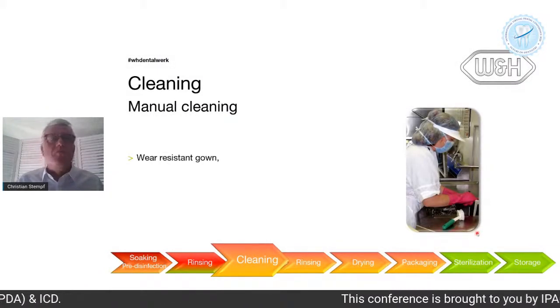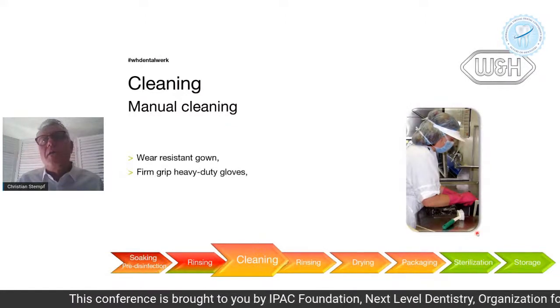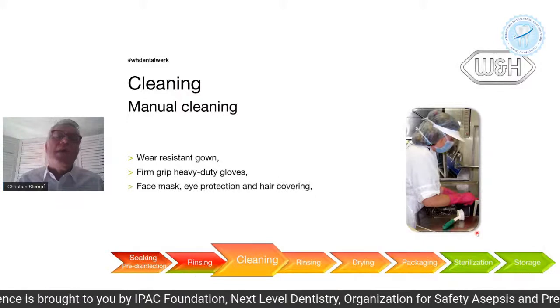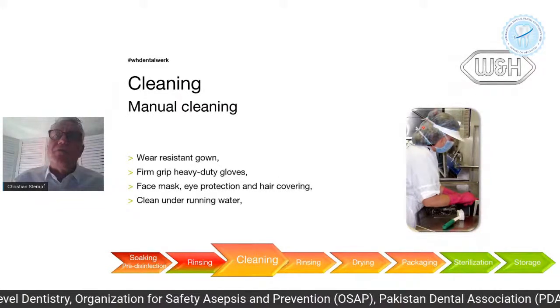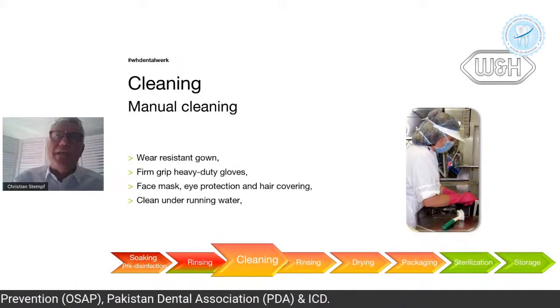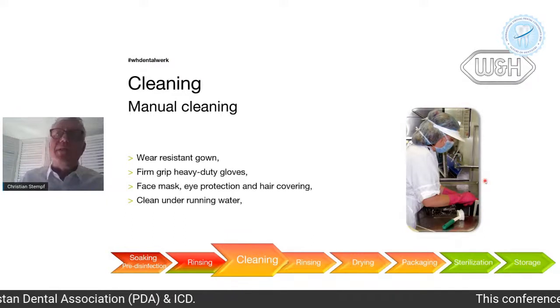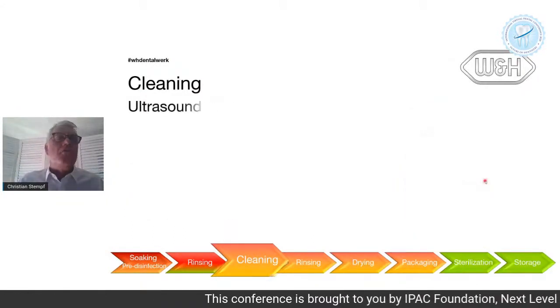random, because depending on the mood, on the experience, how serious your staff is, this is not the preferred choice. She or he must be really covered here, because when you brush the instruments, you recreate this aerosol, which can be inhaled. So you see here, I would recommend that she switches to FFP2 masks. So you should go for ultrasonic cleaning.